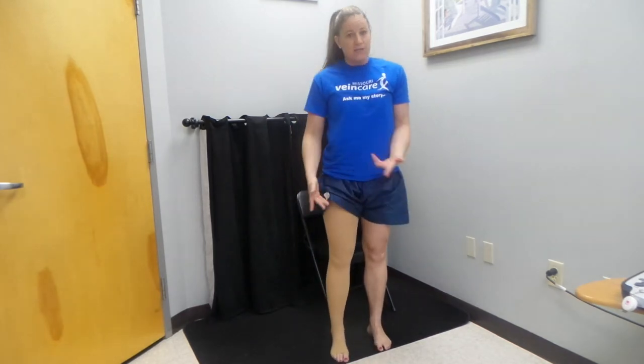So if you notice I have the thigh high stockings on. If you have knee highs, go ahead and start sitting down and you can stick your thumbs inside and you can just start to work the stocking down. However, with the thigh highs you're going to want to start sitting up. Makes it a little bit easier.